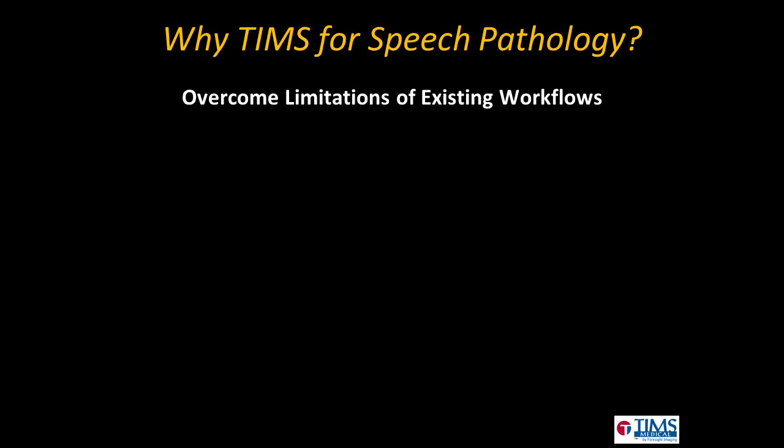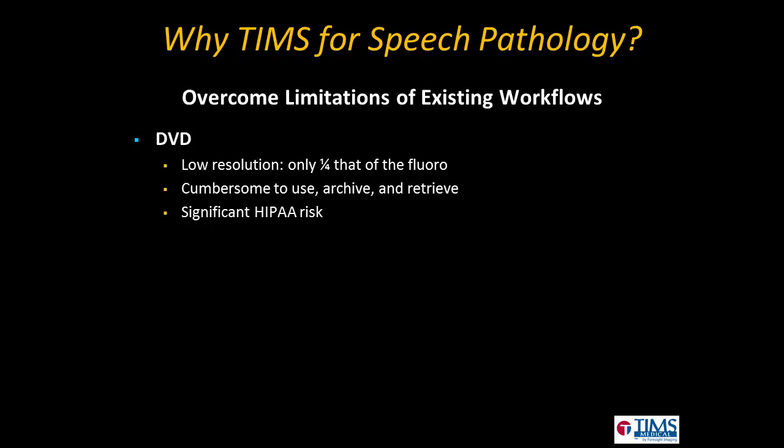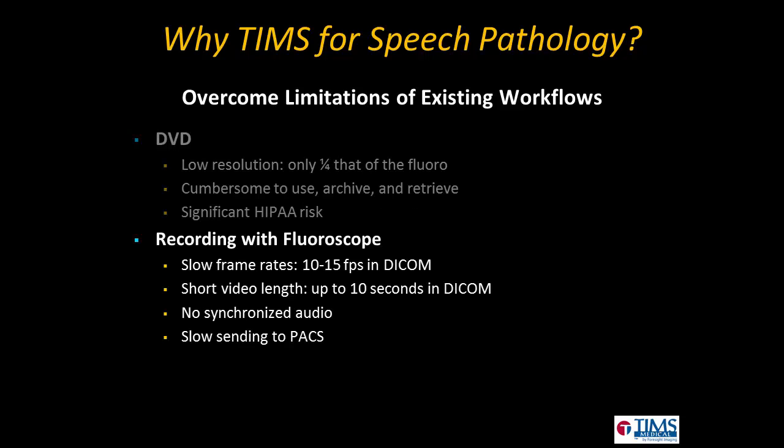If you're watching this presentation, it's likely that you want to overcome some limitations of your existing workflow. If you're currently using DVD to record your MBS studies, you're probably already aware that these are low-resolution devices and only capture about 1/4 of the image detail coming from the fluoroscope. Along with being cumbersome to use in the procedure room itself, archiving and then retrieving recorded studies can be a tedious process. DVDs also represent a significant HIPAA risk for the hospital if they're lost, destroyed, or removed from the facility.